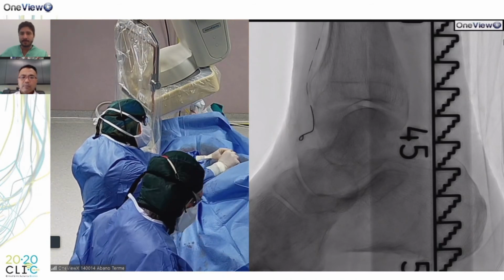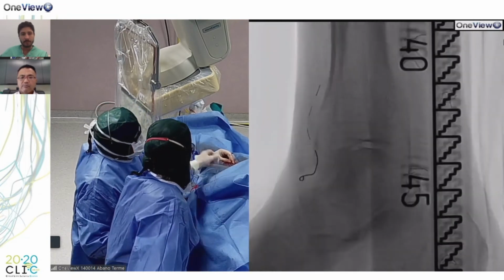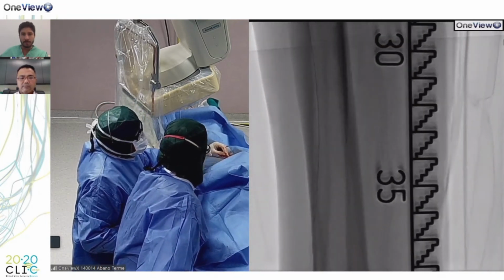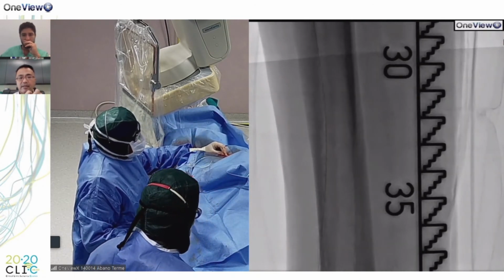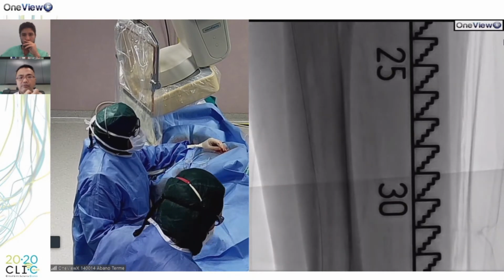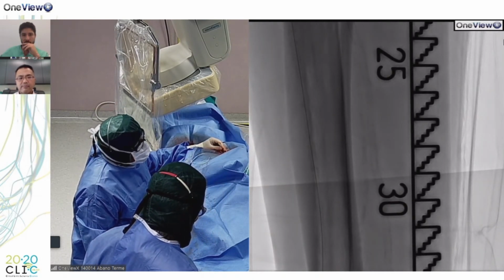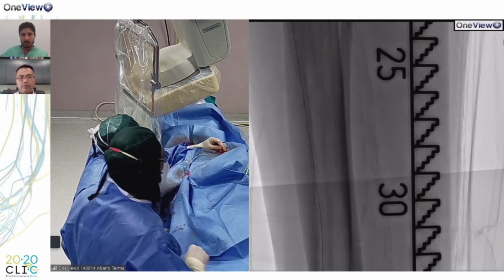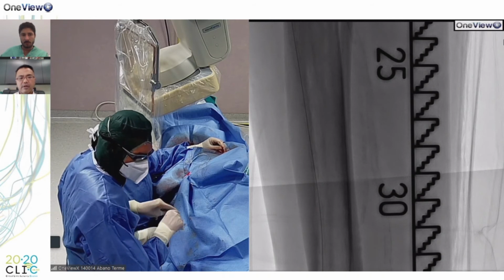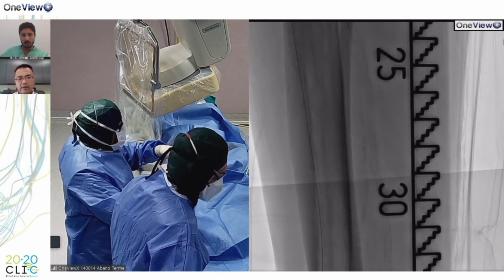Yeah. Could I just ask a question, Marco, with regards to the popliteal lesion? One of the things that I looked at on the IVUS is that it really looks like a very complex, eccentric, almost coral reef-like lesion. Would you consider a primary stenting maneuver where you put the stent and then you do the post-dilatation instead of a high pressure first followed by stenting? Could you consider that?